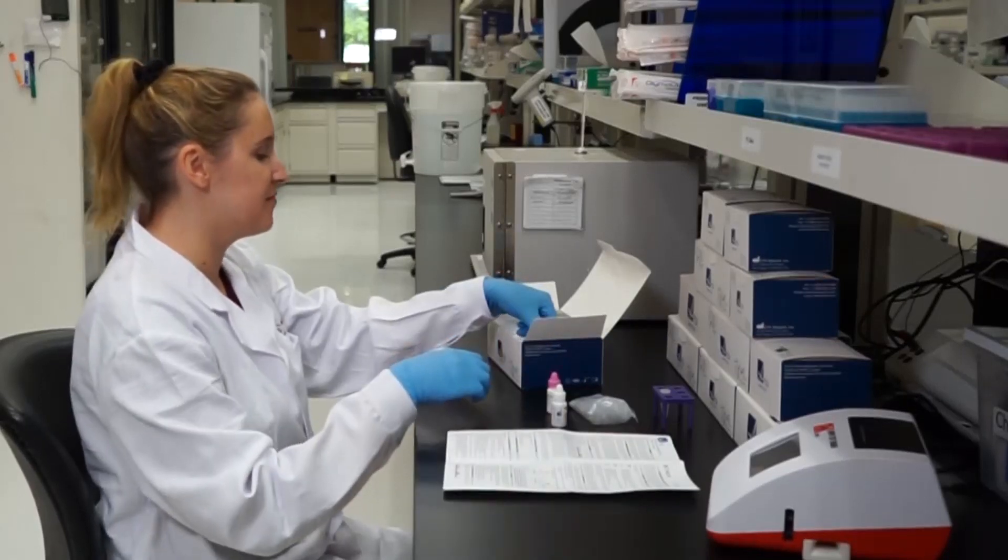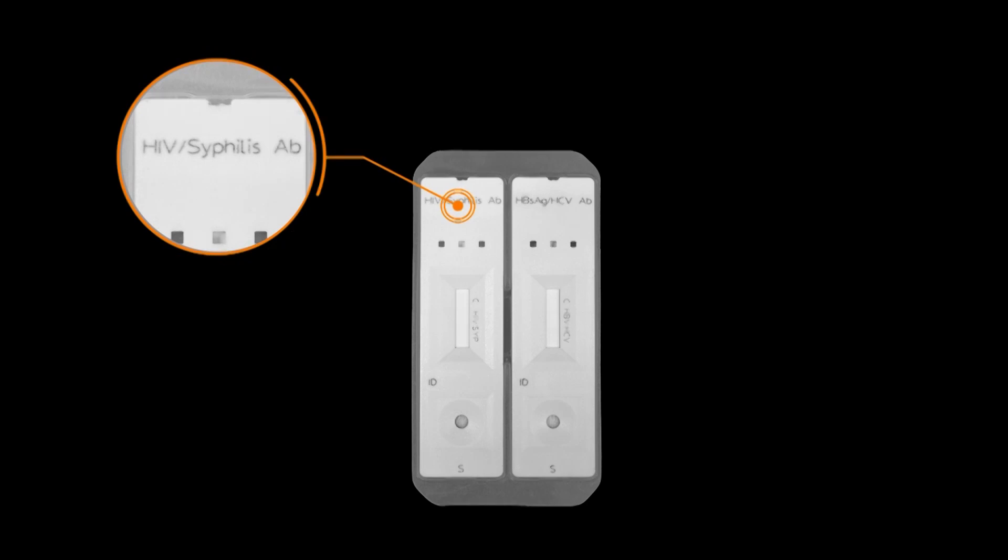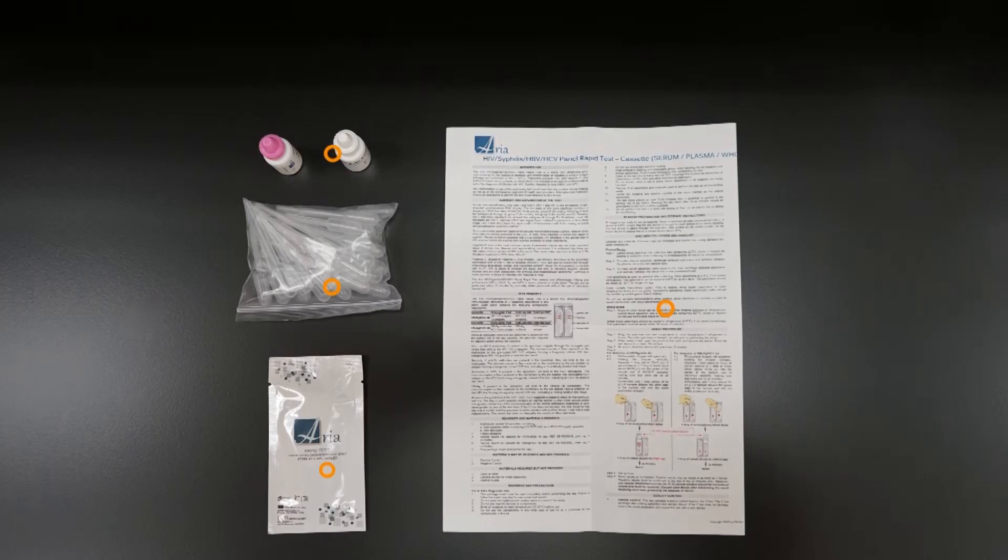This foil pouch contains one cassette holder containing an HIV syphilis cassette on the left and an HBV HCV cassette on the right. This pouch also contains one desiccant to ensure test quality.